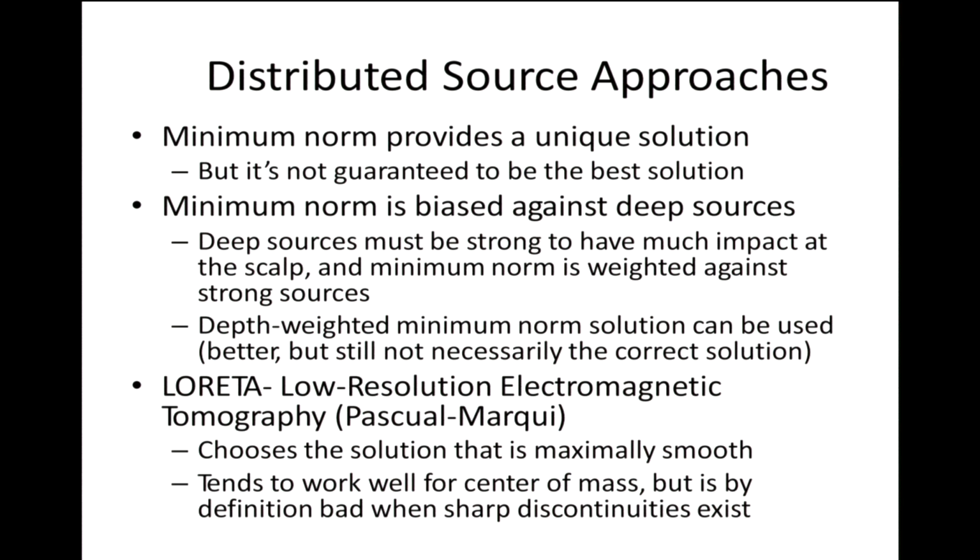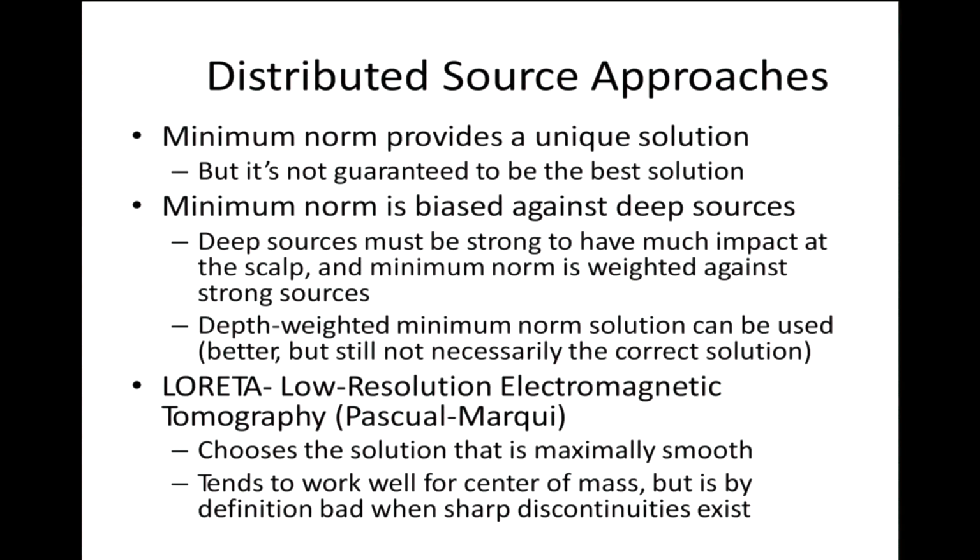You can do this for imaging as well, yes. The only thing is, I cannot tell you at this moment what additional parameters, or whether in the settings you have to choose anything different or not, but the software allows you to do that.